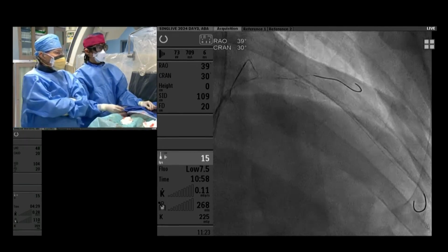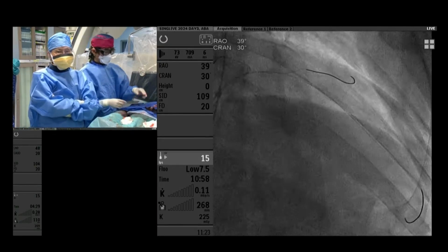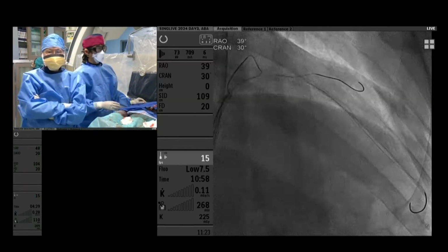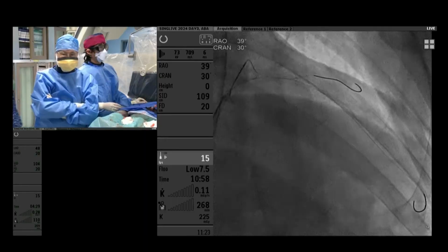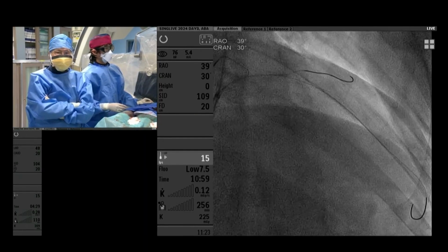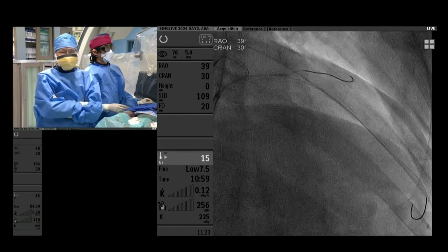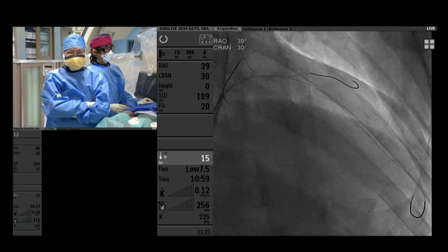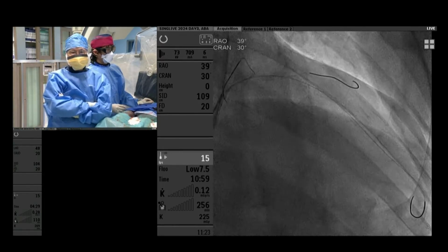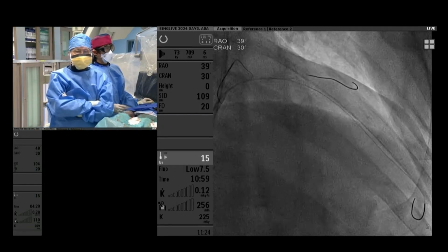So we have already deployed the first stent. So what do you all suggest, the panel? Prof. Ko, there is a prior stent in the proximal LAD. It's a BMS, so it's a bare metal ISR. So either you have to see the angiographic result after your POBA. If it is good, maybe you can consider drug-coated balloon. But that will require contrast. And of course, the other option is to stent. So we'll be interested to see what your choices are.